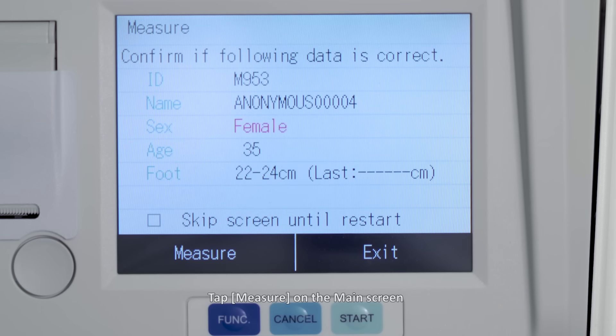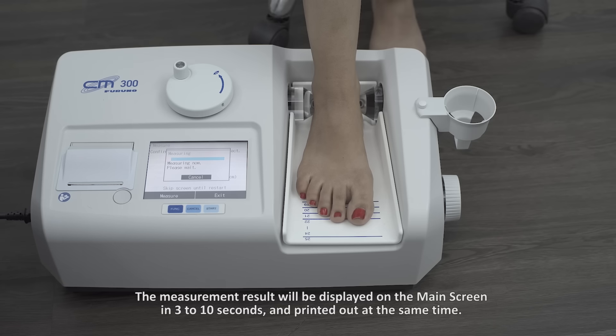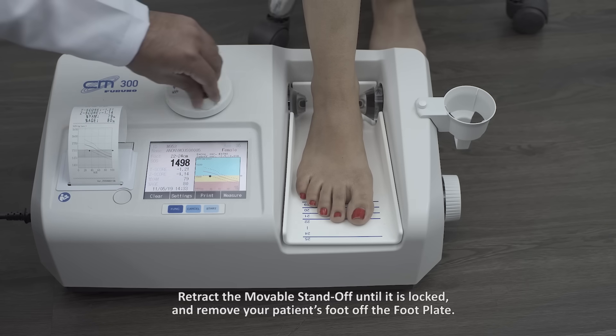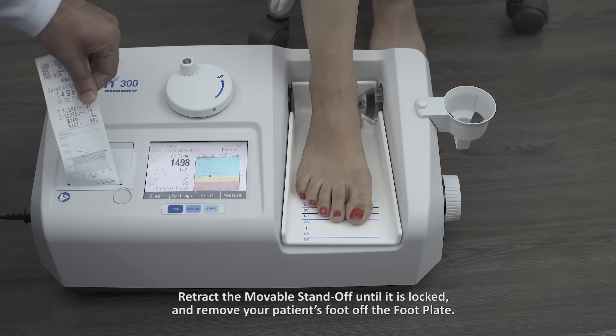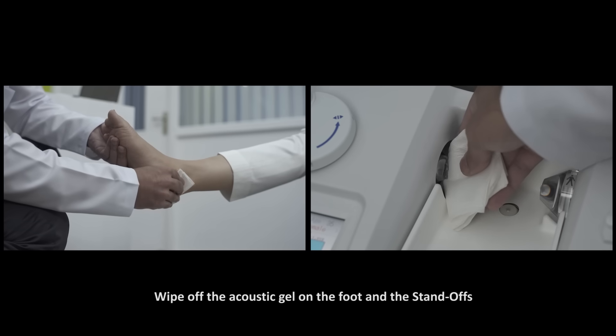Tap Measure on the main screen. Check that your patient's information is correct and then tap Measure. The measurement result will be displayed on the main screen in 3 to 10 seconds and printed out at the same time. Retract the movable standoff until it is locked and remove your patient's foot from the footplate. Wipe off the acoustic gel from the foot and the standoffs.